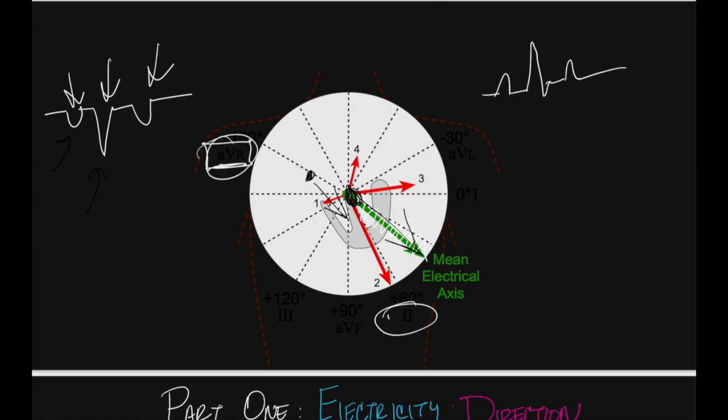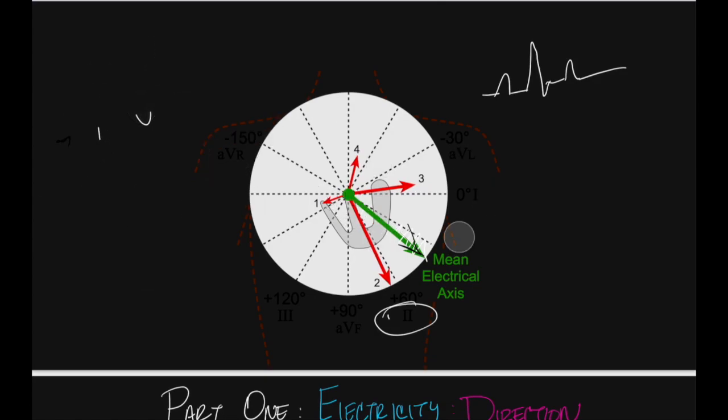Now the thing that is slightly less obvious, however, is when something moves past the electrode. So let's take a look over here at AVL. We see under normal conditions, the P wave begins, and if we draw a perpendicular line, we see that the atrial activity approaches it and then passes it as it moves through the ventricle.